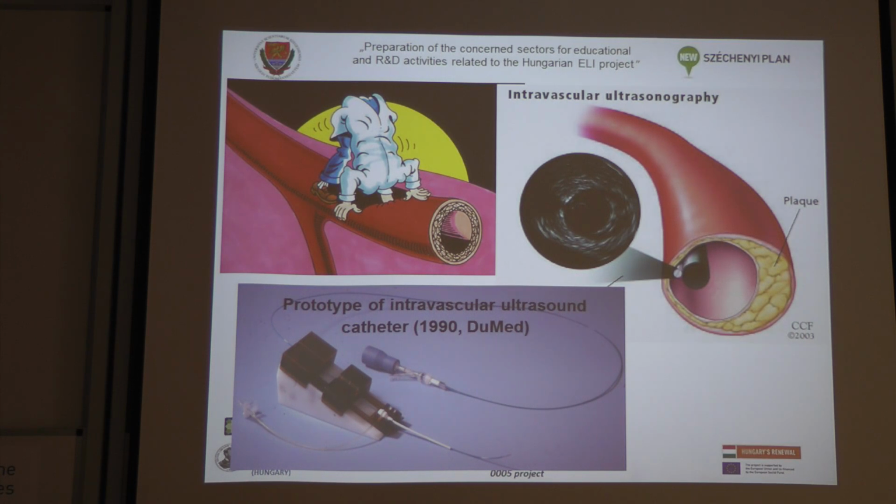So optical coherence tomography, this is something new, maybe a third generation of what we use already. But the very beginning of this whole, let's say, new change in paradigm was the introduction in the early 90s of the intravascular ultrasound catheter. Beforehand, only the pathologists who examined only the already deceased patients really realized the problem that all the things really are in the arterial wall.